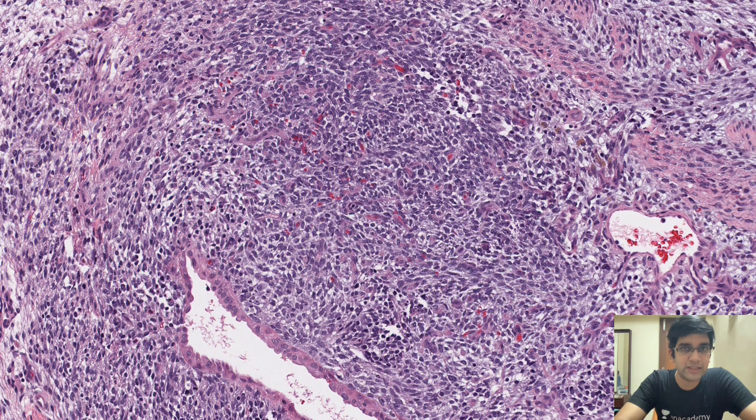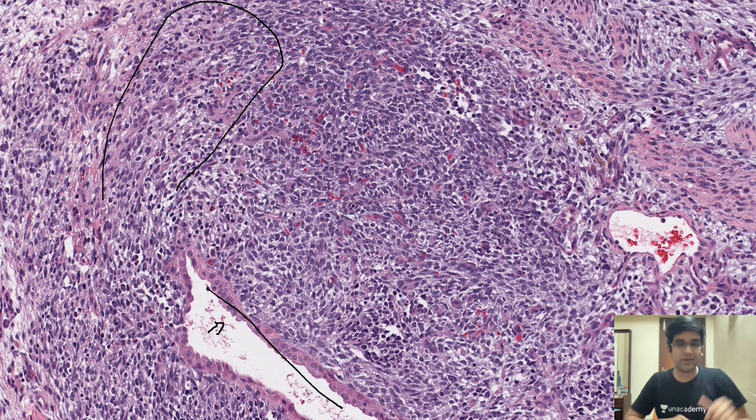Again, when you see the same image, you can see the mesothelial lining here, right? I'm having more of the small round blue cells, but one thing which is primarily taking me away from lymphoma or the leukemia ALL is the spindly nature, right? Somewhere it goes up, it becomes elongated. In lymphoma it is more classical, a characteristic finding, but still, one of the differential diagnoses is small round blue cell tumor. There are lots of tumors, and one amongst them could still be lymphoma. Fine. Go to the next image.